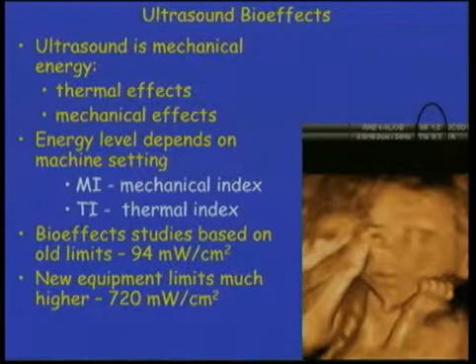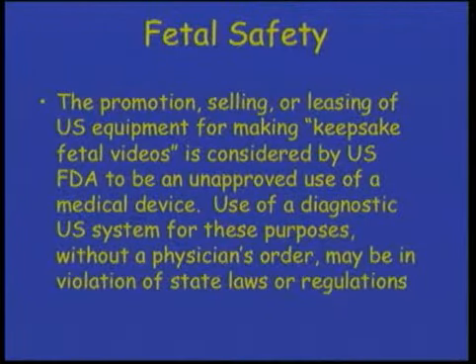So the main point for you is that you don't sit and scan a fetus forever. You mainly try to get in, look at what you need to look at, and then get out. Because raising the temperature in the fluid around the baby is not healthy for it, and we don't want to do it for prolonged periods of time.